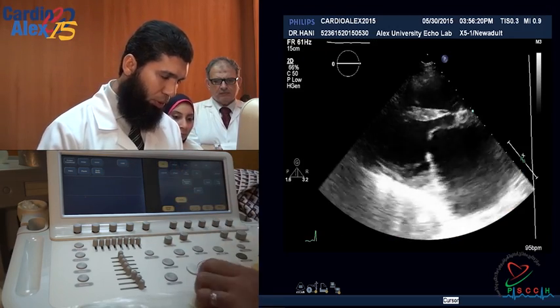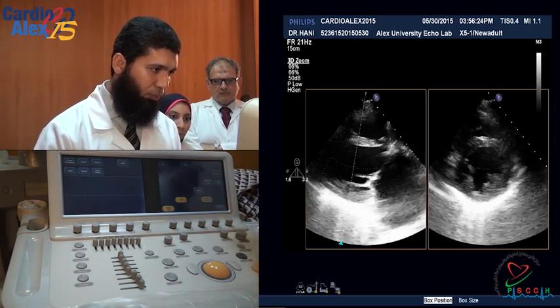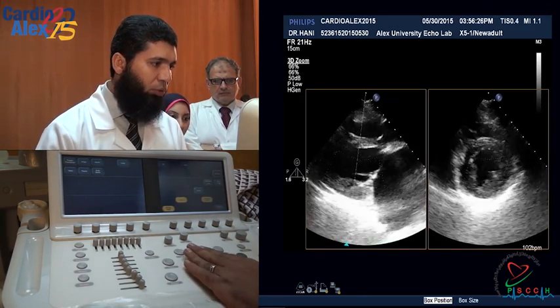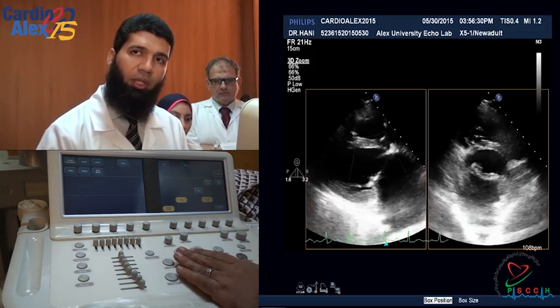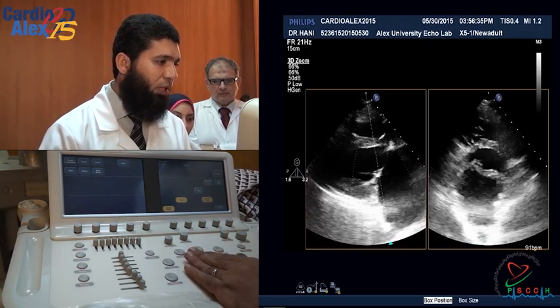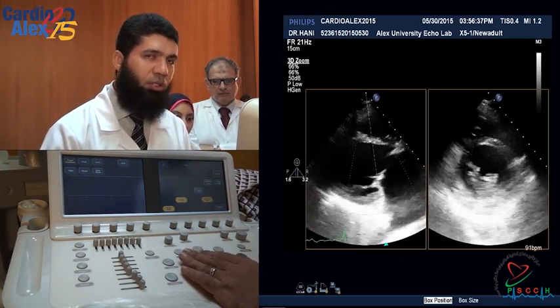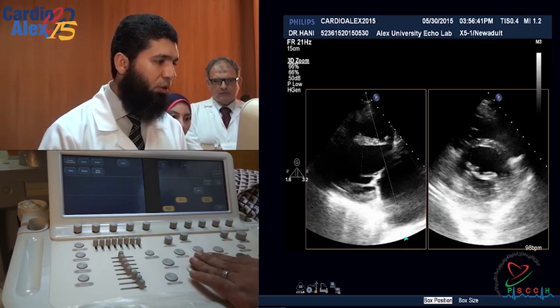Back to the 2D, I have the 3D zoom. By clicking 3D zoom like in 2D zoom, it will give you a box first. You will optimize the box, then you will acquire, it will give you the zoom structure. In the left-handed side, this is my reference image. The box here, I can control the box position up and down.